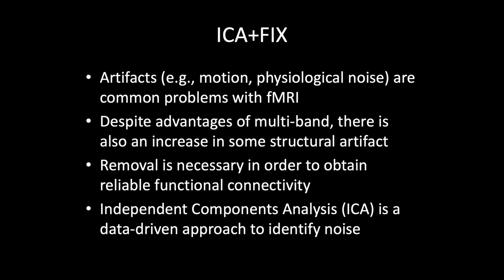So as we know, artifacts are common. That's been, I think, hammered in. And despite the fact that we have advantages with using multiband, there's still some artifact that's going to occur. And if you're interested in doing functional connectivity analysis, that's something that you want to clean up because you don't want artifact to interfere with the relationships that you're trying to look at. So the approach that HCP uses is to apply independent components analysis as a way to identify noise.